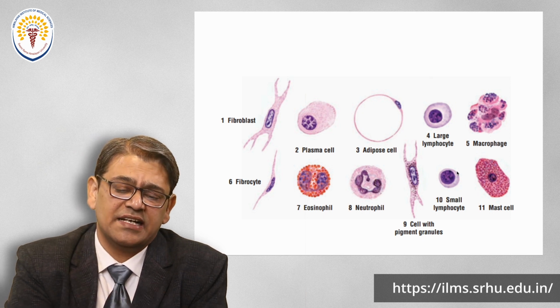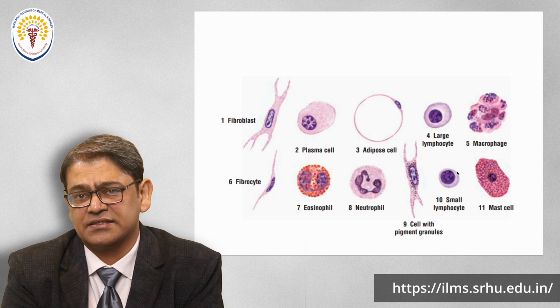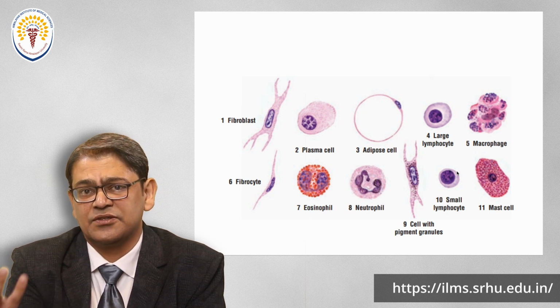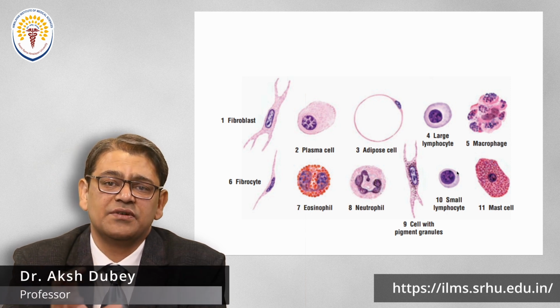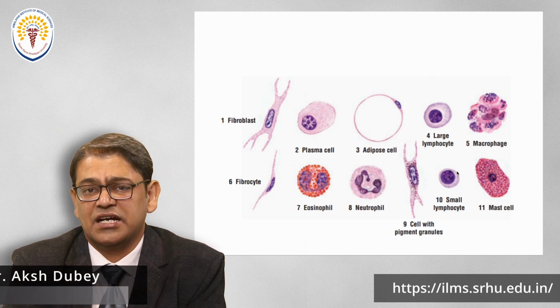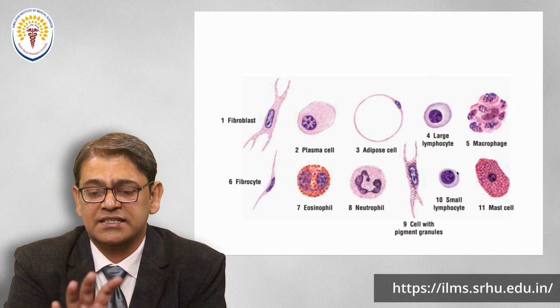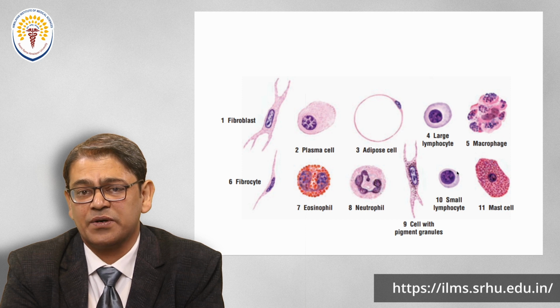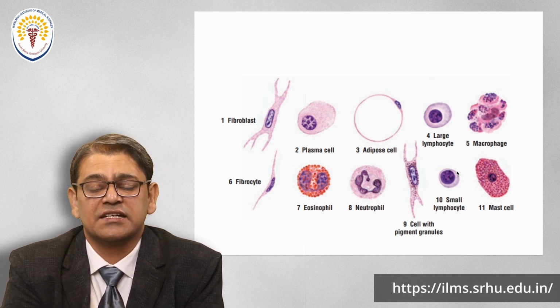In certain areas, certain cells are more present, while in another area, certain cell numbers are reduced and another group of cells dominates. So you have to analyze where you are taking the tissue from and what you are visualizing, or vice versa, if you are visualizing this, what could be the organ or the area from where this connective tissue has been collected.